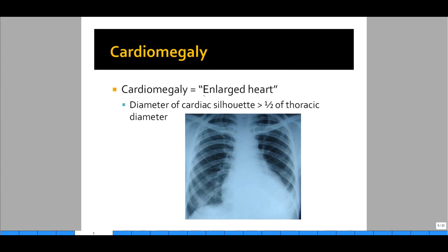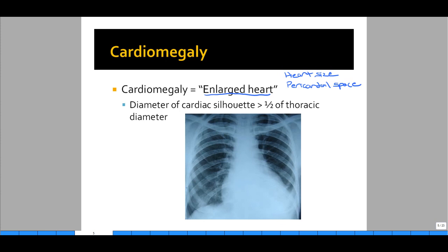So let's get down to identifying cardiomegaly. What is cardiomegaly? Cardiomegaly means an enlarged heart — in quotes because the cardiac silhouette is composed of two things: the actual heart size itself, plus a pericardial space. Usually there is no real enlargement of the pericardial space, so the cardiac silhouette tends to just represent the heart size. How do you identify cardiomegaly on a chest x-ray? Look at the diameter of the cardiac silhouette and compare it to the diameter of the thoracic cavity. If the cardiac silhouette diameter is greater than one-half the thoracic diameter, then cardiomegaly is present. You can easily do this by just using your fingers to measure and compare.